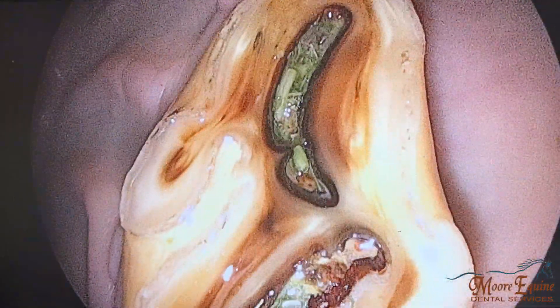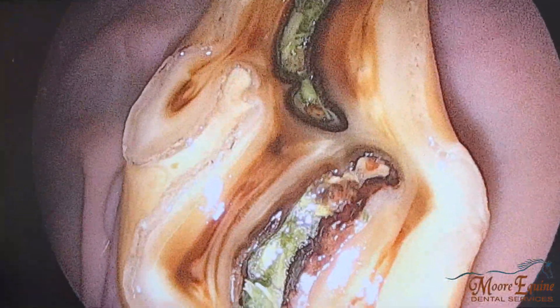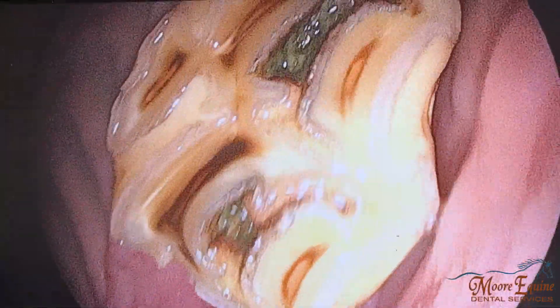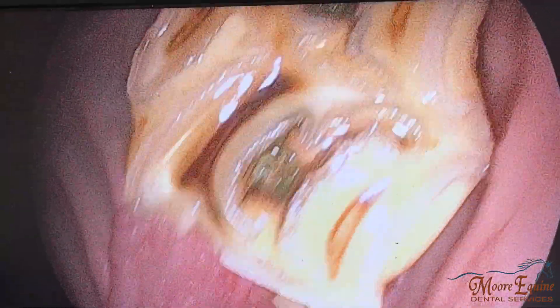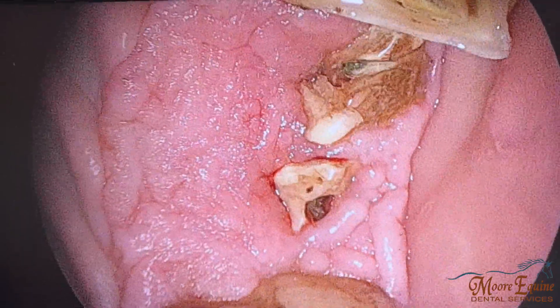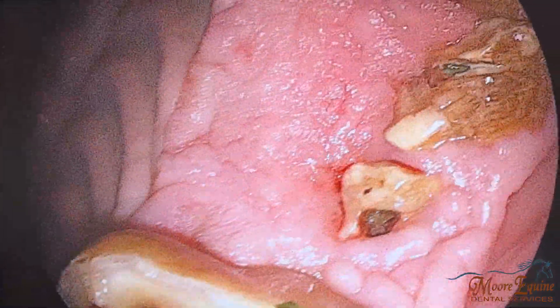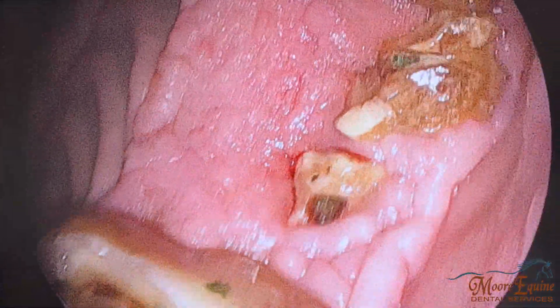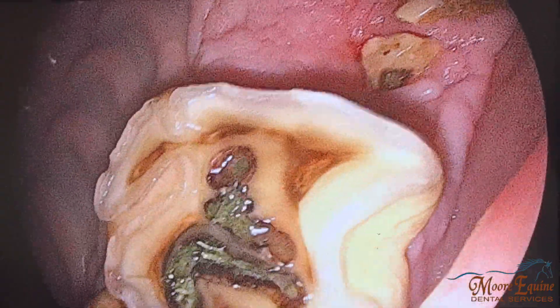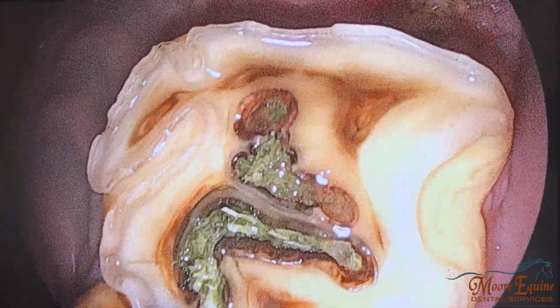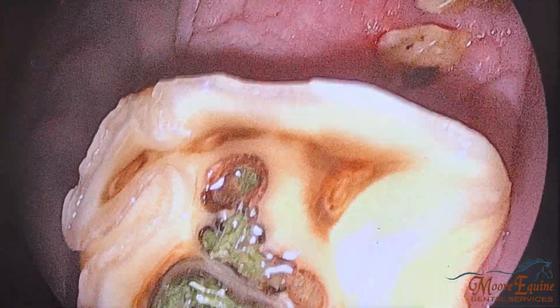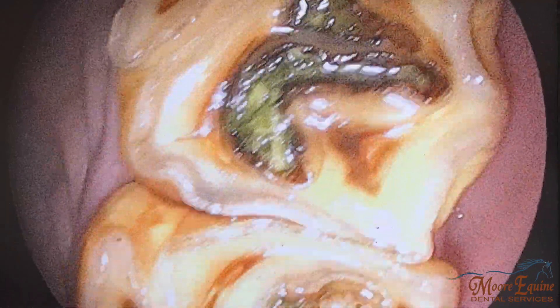Coming over to the other side, we can see some grade two caries here on the six, grade ones here, and then here we have the tooth that was fractured with some fragments remaining under the 208 and 209. The mesial infundibular is almost expired and there's some caries on the distal.